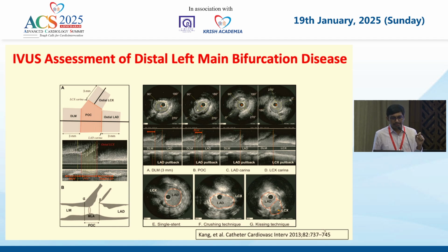And how do you segment your left main into different parts? It is almost like what is happening with your bifurcation QCA. It is divided into 4 segments. Just see this longitudinal view, where is the inflection point of your side branch. The vessel proximal is your main vessel. And just see the figure of 8 from the side branch and main vessel pullback. Where you see the first frame of the figure of 8, that is the ostium of the distal main vessel or side branch.